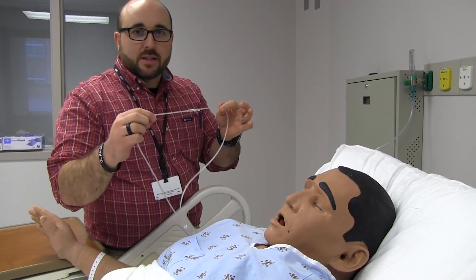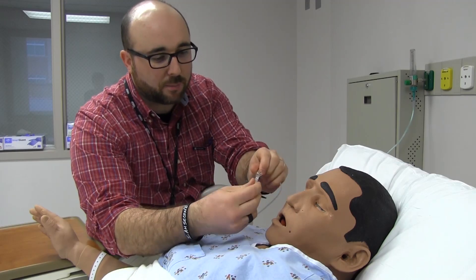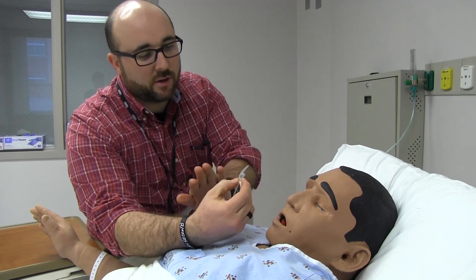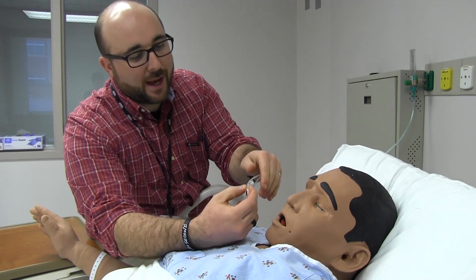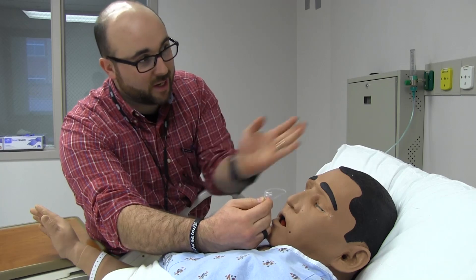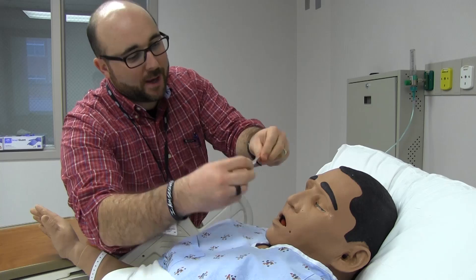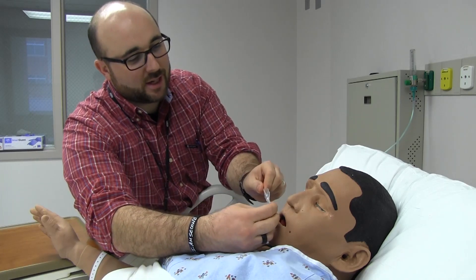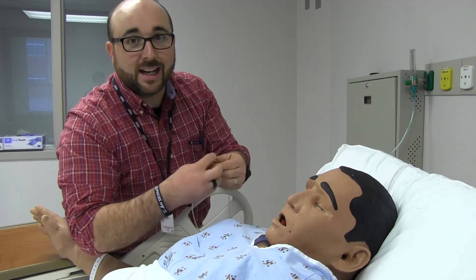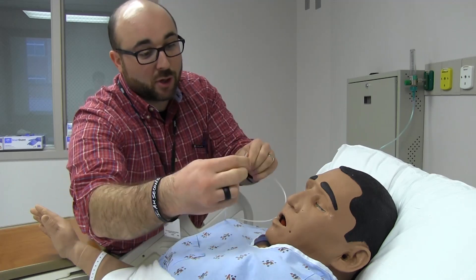I'm going to apply this to the patient's face. You'll notice there is a little bit of a curvature to these cannula prongs. What you want to think about is: are these going in and following the path of the nasal cavity? The nasal cavity does not go up — it goes back and around. So these always curve back like this. If you put them on backwards, it's going to oxygenate the epithelial cells on the inside of their nose, but not get down into their oropharynx and lungs where you really need it.